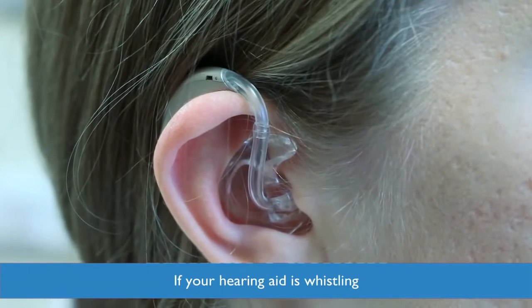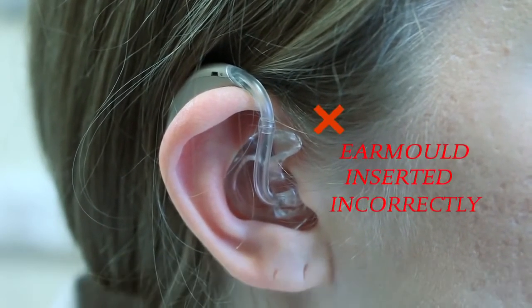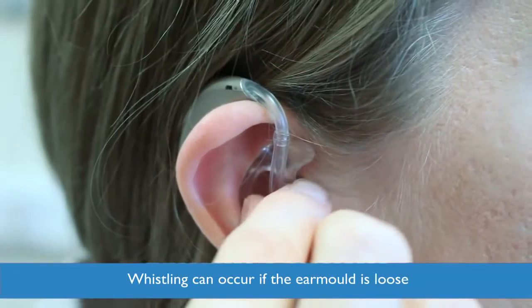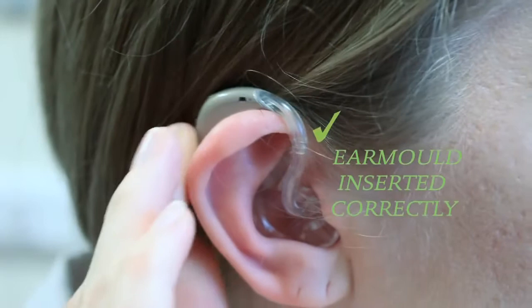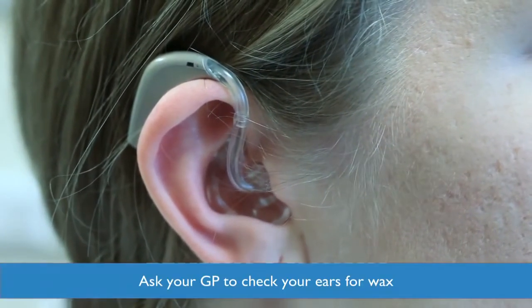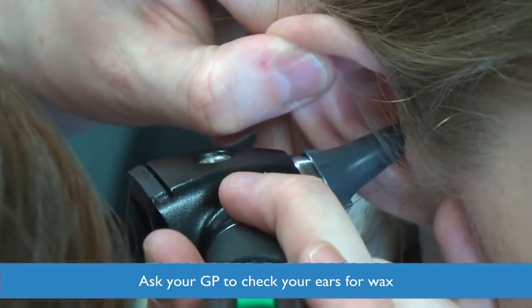If your hearing aid is whistling, please make sure you have inserted your ear mold correctly. If the ear mold is very loose, then this can also cause whistling, and we may need to make a new one. You will need to make an appointment on the repairs clinic to have another impression taken. Also, ask your GP to check your ears for wax, as this may also be the problem.